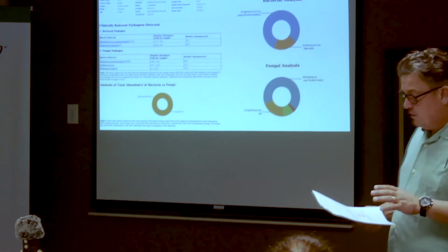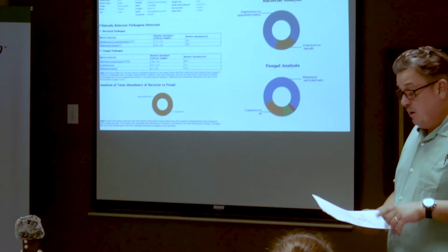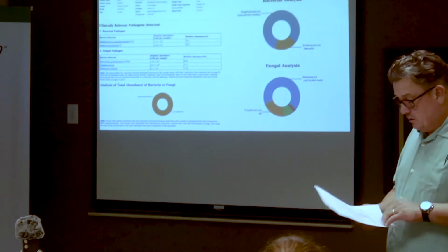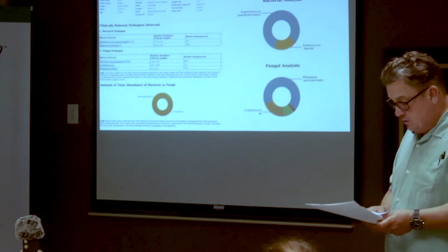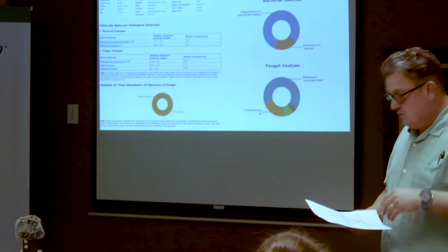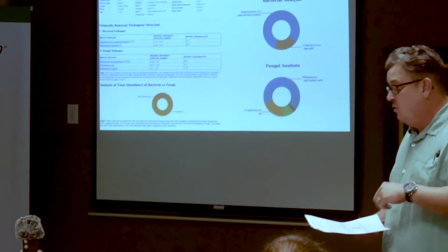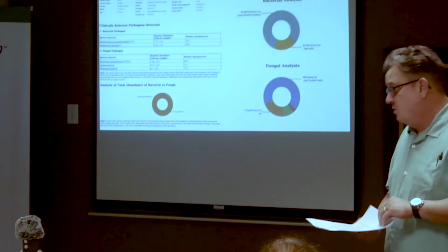When I look at this first page, you see that there's also Enterococcus on there. I never got that on the 2 cultures I was able to do. It never came up. There were also some fungi in there. But if you look at the ring at the bottom, it says bacteria 100%, fungus 0%. That told me that this is a bacterial infection. There's no fungal matter there at all. There's very little. I took it as either a contaminant going through the skin when I'm doing my cystos, or just cellular debris at the bottom of the bladder. One of the two.